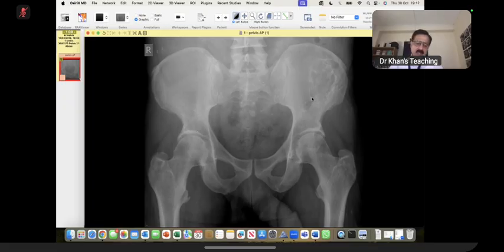You are describing the finding, then you are reaching a differential, and then giving a principal diagnosis. At that point, you should not start describing it again and then describing it again. And this is a pattern which I saw in you, even in your pancreatic case and even in the brain case also. So this is the key take home point from my side for you.